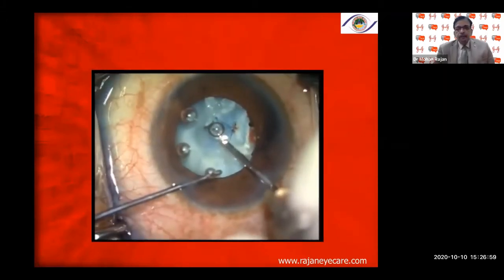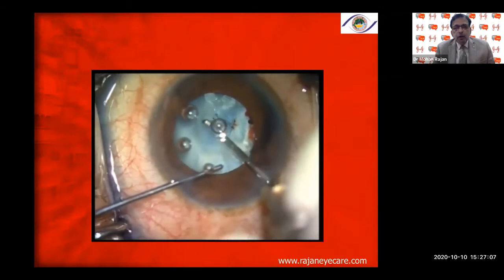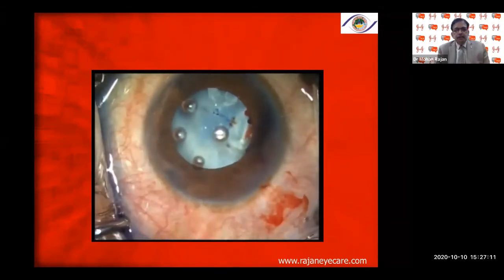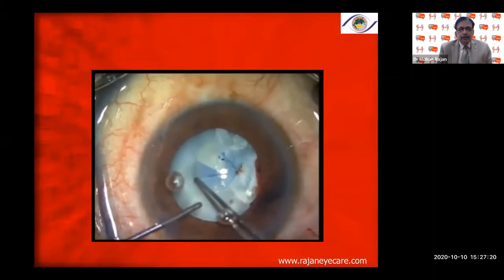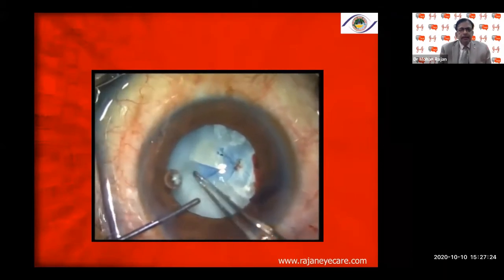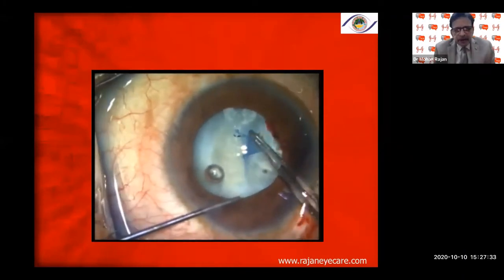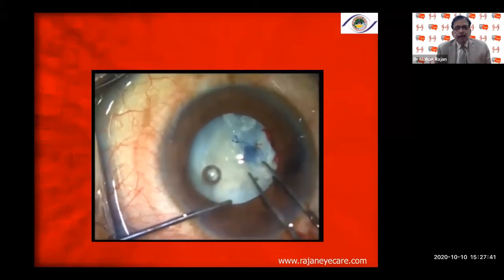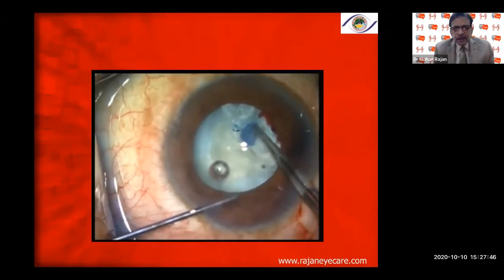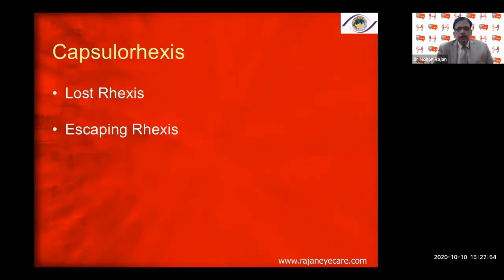Completing with the Utrata capsular rhexis forceps. In the hypermature cataract, Type 3, with calcified anterior capsule, it is very difficult to do the capsular rhexis — sometimes you might have to cut with vitreous scissors or Vannas scissors, as the capsule can be very fibrotic and calcified. These capsular rhexis tears will never extend back like in Type 1 cataracts. Staining of the anterior capsule is very important; in the area of fibrosis, you may sometimes have to cut using scissors.